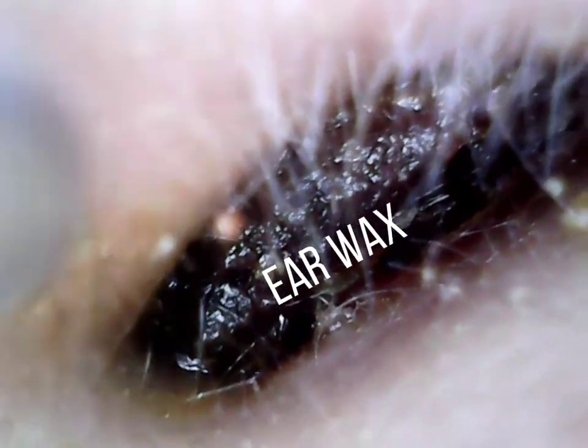When we look at the beginning of the ear canal, we are seeing big, massive earwax. We need to get it out, and we are using pickups for it. The biggest part of the wax is removed, then we take out the other small pieces.